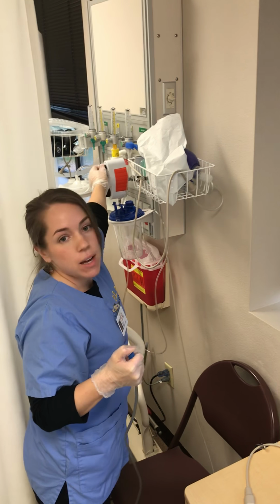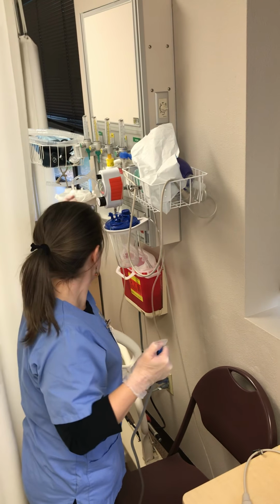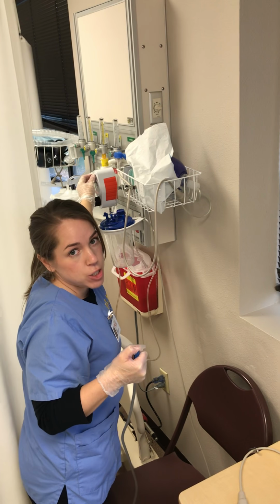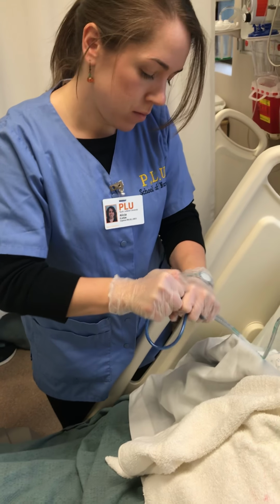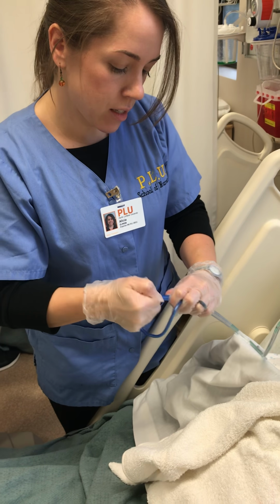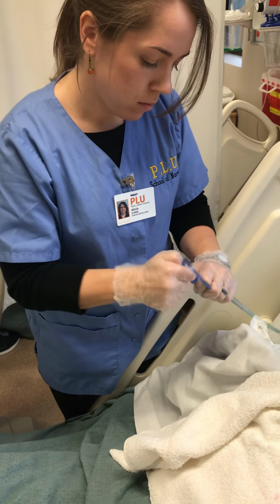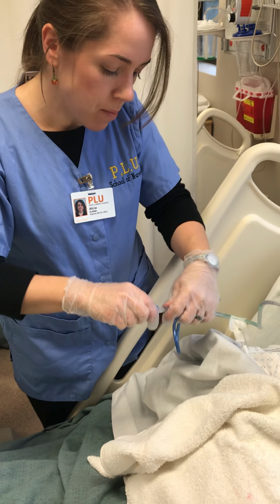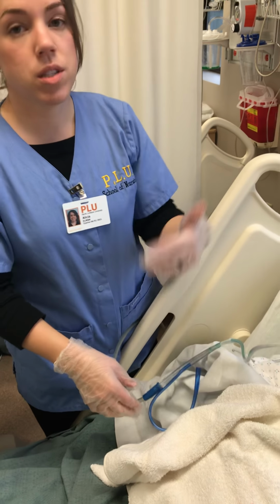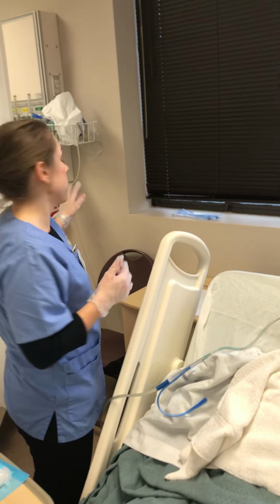And then once I have it in the right spot, what I'm going to do is turn it over to intermittent. And then I'm going to come over here, make sure my spike stays on the tube. And then I'm going to hook the patient up and make sure the stomach contents is flowing into the vacuum.